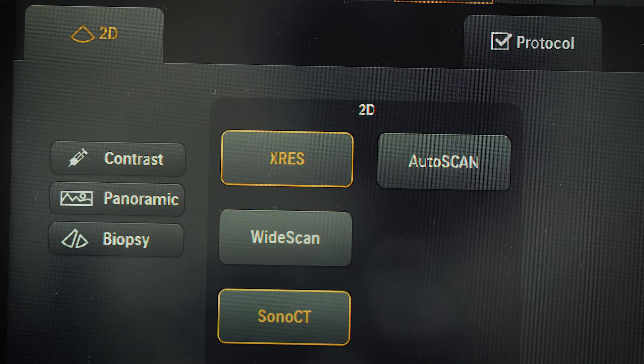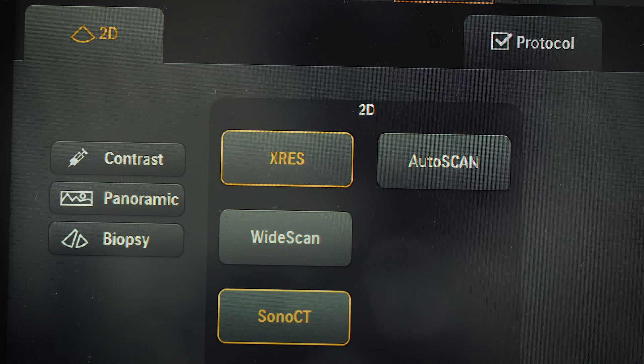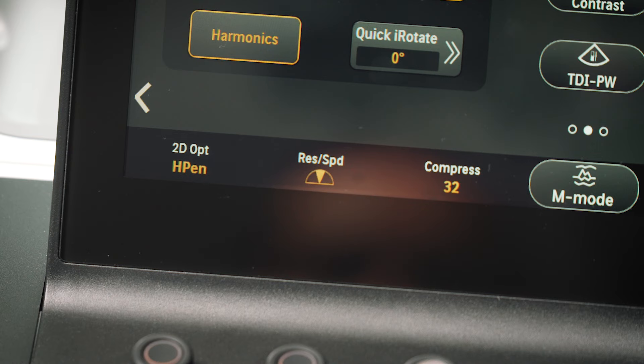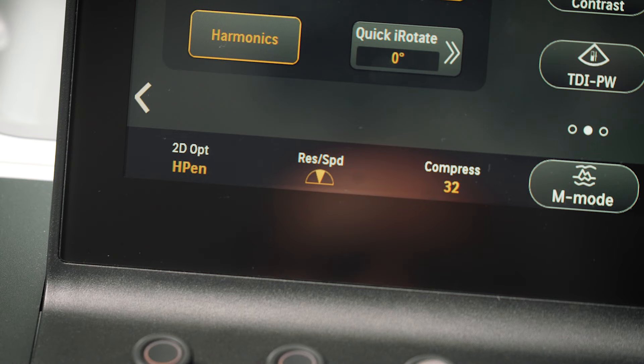X-Res can be found on the first page of the touch screen. X-Res settings optimize image sharpness to user preference. There are five levels, with one being the sharpest image and five a more speckled or smooth appearance.